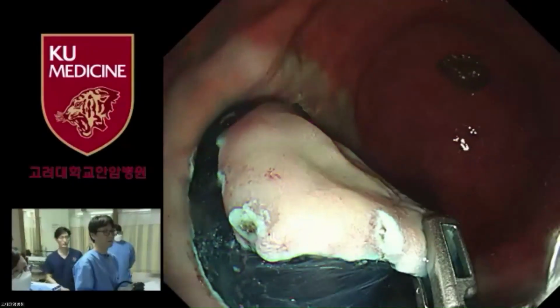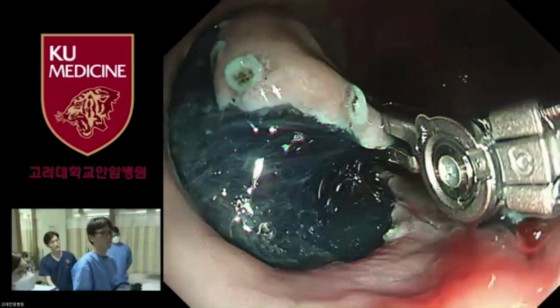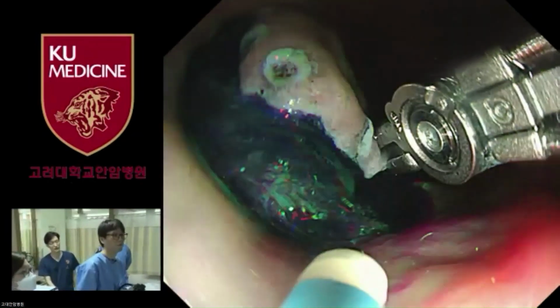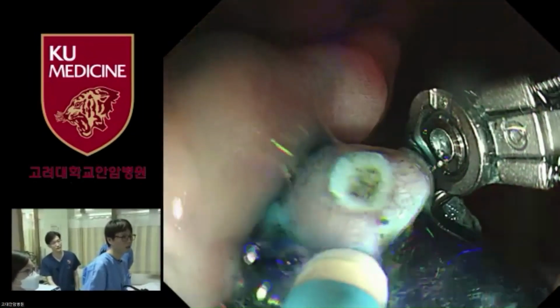Yes, we've been conducting a clinical study for 1 month, and we have more than 10 cases, 10 to 15 cases, for the gastric ESD.